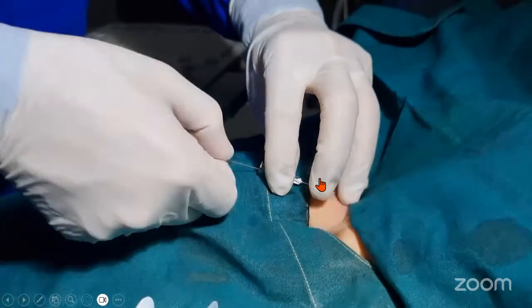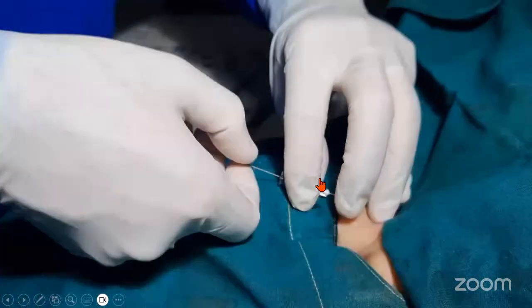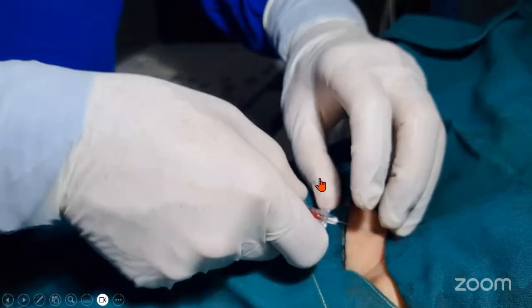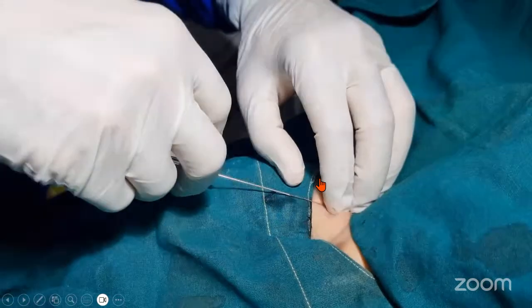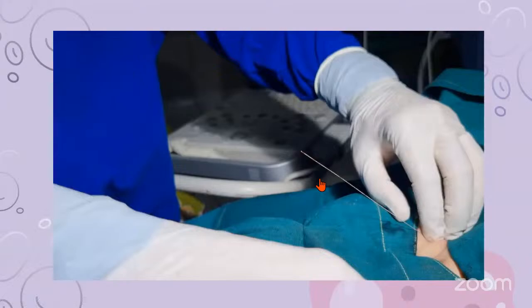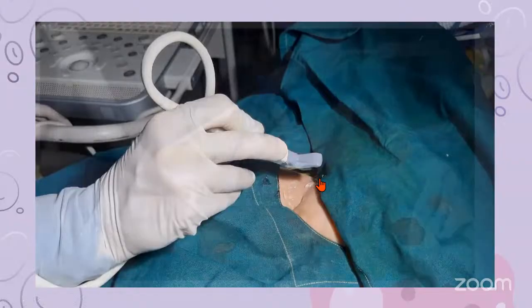Don't insert it fully. Personally, what I do is, till it crosses your needle tip by 1 to 2 centimeters, I stop there. Then we press the guide wire and take this inserter needle out. And then from there you can insert the catheter. So this is how.